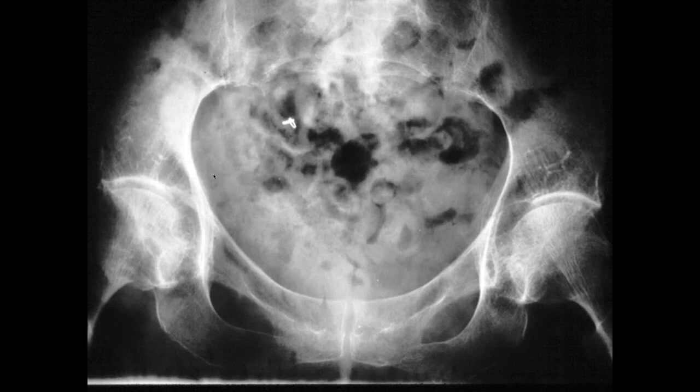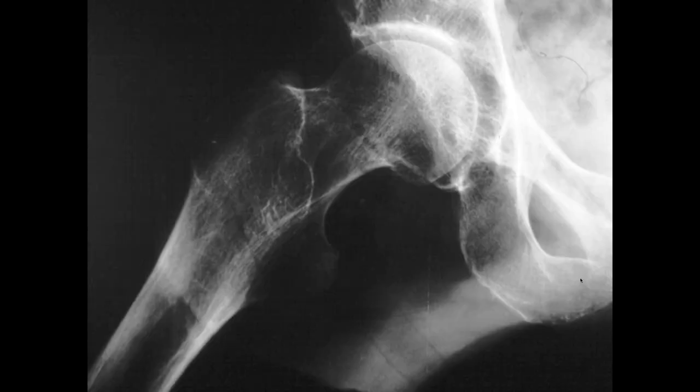Okay. So, Michael, here's a patient with right hip pain. And left hip pain? Okay. Because it looks like they've got bilateral foreshortening of their femoral necks and chronic changes. It's just positioning? Okay. Well, their femoral heads look abnormal, like there's been bony remodeling. Here, now it looks normal, or normal-ish, the femoral heads. There's a subcapital non-displaced transverse femoral neck fracture, though.